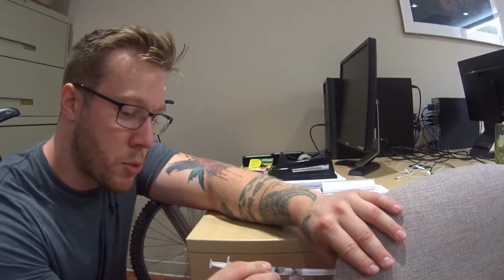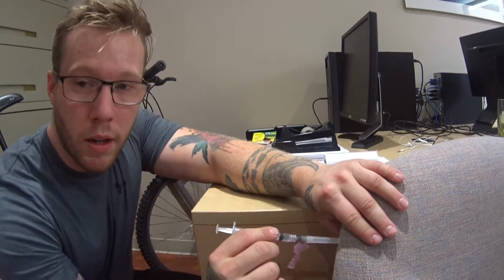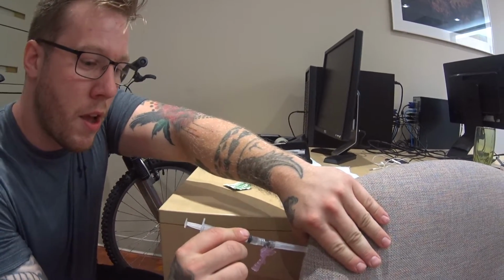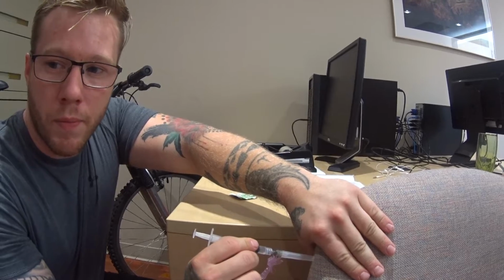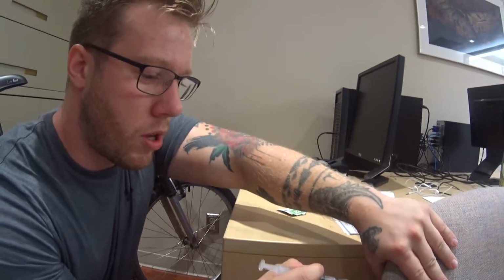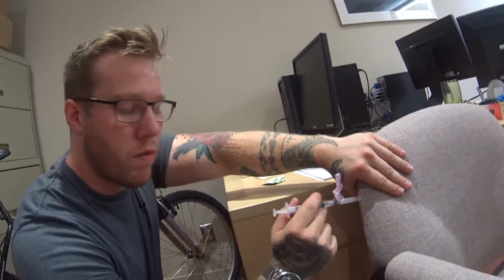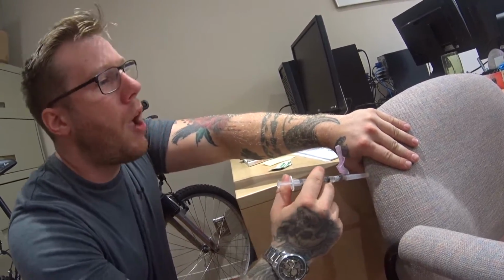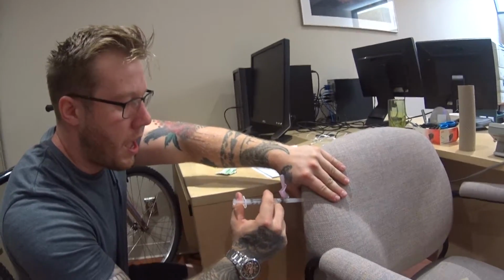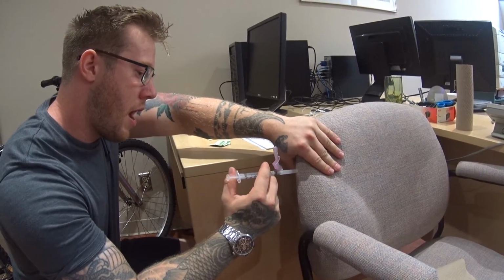If we see flashback of blood, we're going to have to redo this medication. We'll take the needle out and redo this whole process. But if not, which is the case today, we can go ahead and inject the drug. So I'll inject the haldol haloperidol into Mr. Milton's deltoid over a period of about 10 seconds. I'm going to look at Mr. Milton's face, ask him if he's doing okay, and see if he's in any sort of pain. No pain, and the needle's injected.